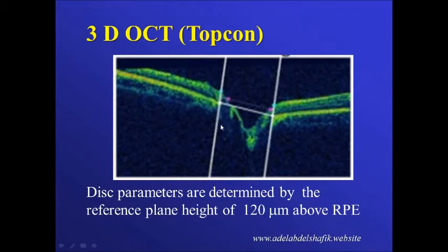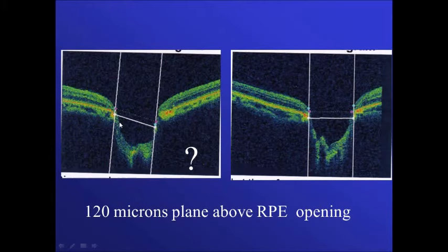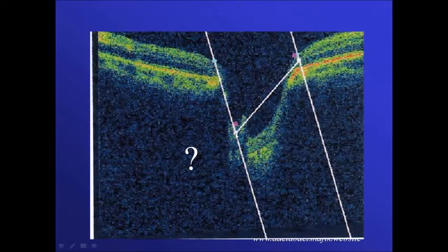In the TOPCON machine, after identifying where Bruch's membrane ends, a reference plane 120 microns higher marks the location of the neural tissue. In this example, the machine calculated the end of Bruch's membrane at an incorrect location — flagging it as abnormal — and so all the measurements were abnormal, when the correct boundary was elsewhere.